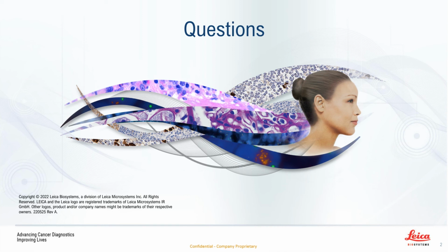Again, it's one that doesn't necessarily have a straight yes or no answer. This is really going to be dependent on the scanner and the scanner mechanism. Some scanners will employ a technique where they lay down a focus map first, so they will automatically detect where your tissue is, and then they will lay focus points on top of that tissue to map that microtopography across the tissue and have a scan map that it follows.